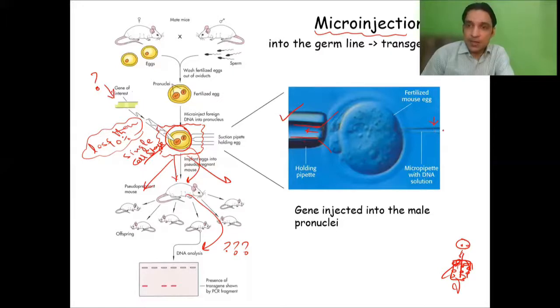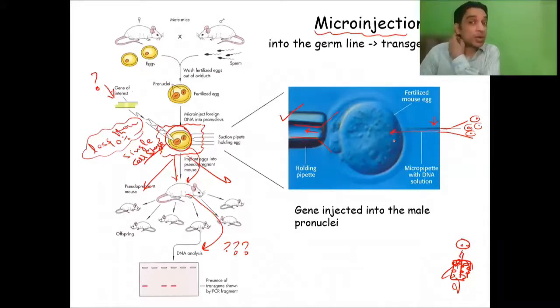And that injection needle comes from a source, and that source contains those things. Those things might be viral vectors, virus particles, or plasmids. And you inject it right within the zygote. Assuming what? You are assuming there is a nucleus in the zygote, and that nucleus contains chromosomes.